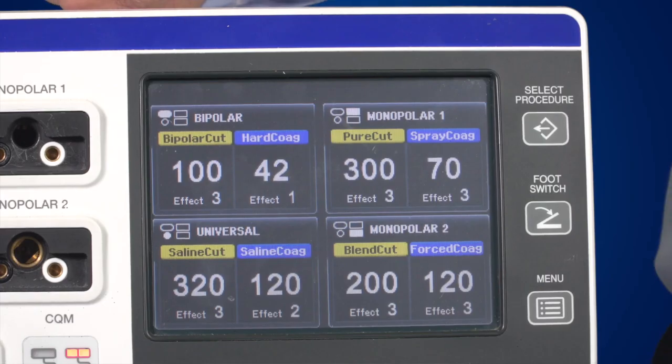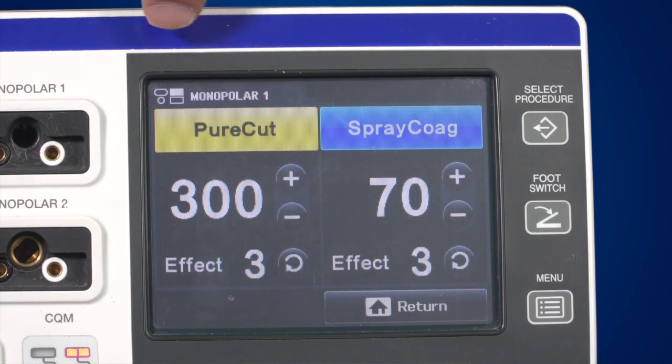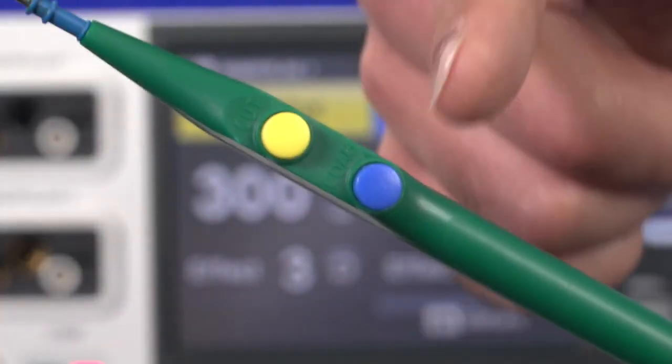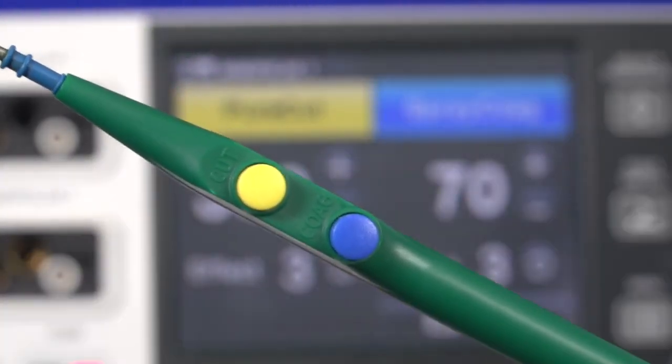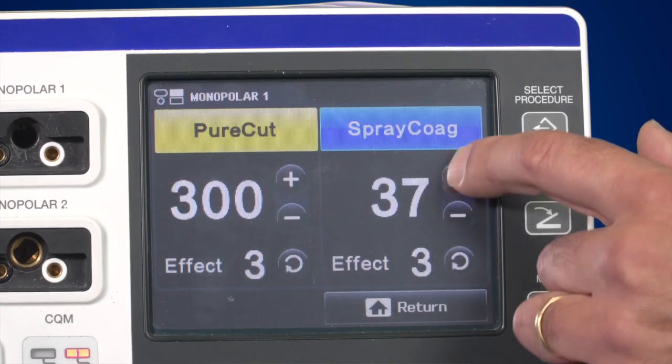A single screen can be selected by opening the corresponding window; it only shows the settings of the selected connection area. For example, here we choose the Monopolar 1 button. You can see and change the settings for Monopolar 1 — including a description, a symbol for the connector socket, a yellow cut field and a blue coagulation field. The colours correspond to switches on the instruments. If you connect only one instrument to the generator, it is advisable to only have this instrument show up on the display. To change the maximum output power, press the plus and minus buttons accordingly.